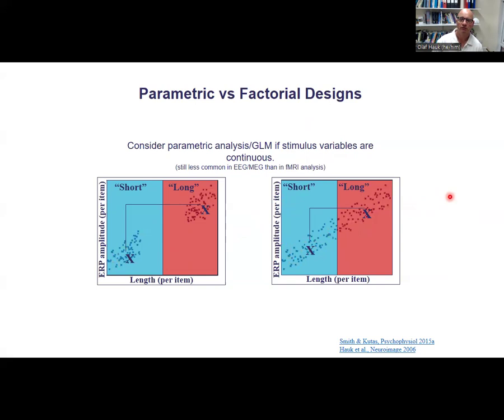This is actually the general linear model that is routinely applied to fMRI data. With fMRI data, you have to apply a model like that because you have overlapping brain responses. With EEG and MEG, this is not usually done because you don't have overlapping brain responses and you can get the individual averages and therefore clearly separated brain responses. But now if you want to do something like that, because you have continuous variables and you don't want to average different conditions separately, then you can. It's linear regression, multiple linear regression applied to EEG and MEG data.